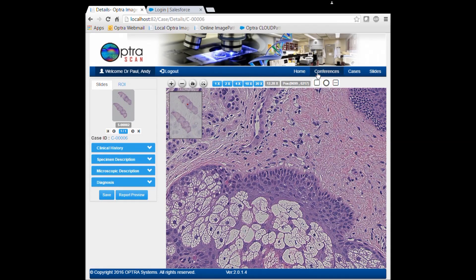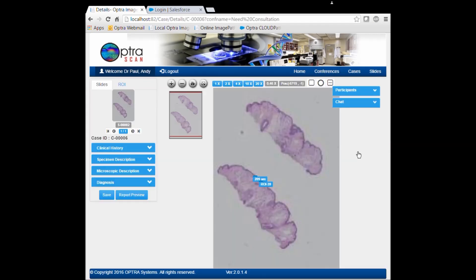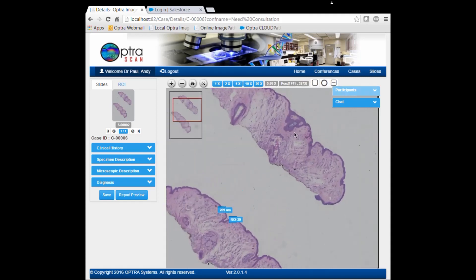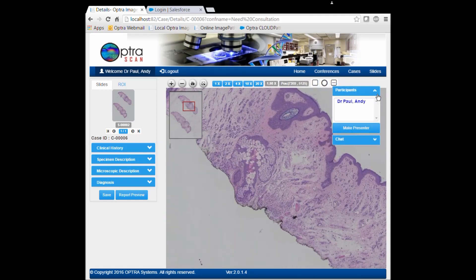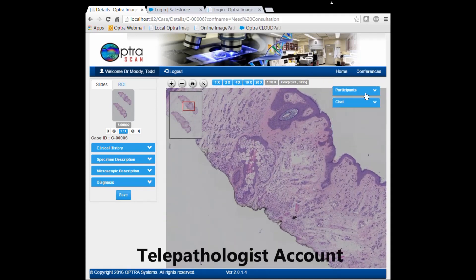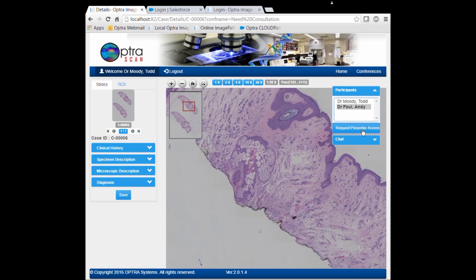The pathologist also has the option to consult other expert pathologists around the world using the telepathology conference feature integrated into the system. Creating a new conference will send a message to all invited parties with secured login access to the system, and then the host can start screen sharing the image with them.